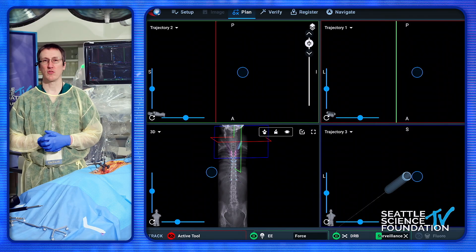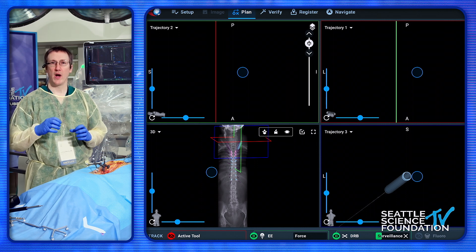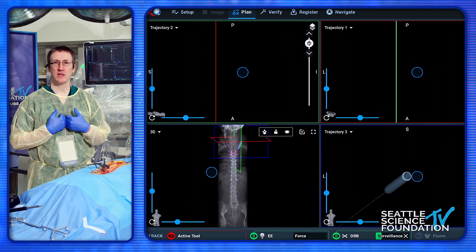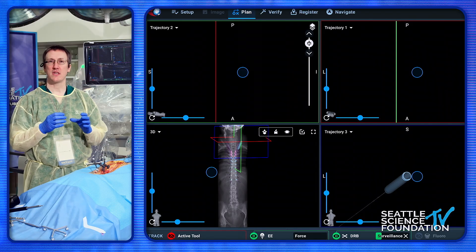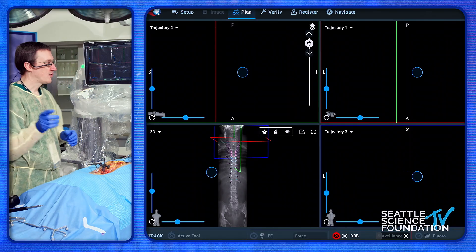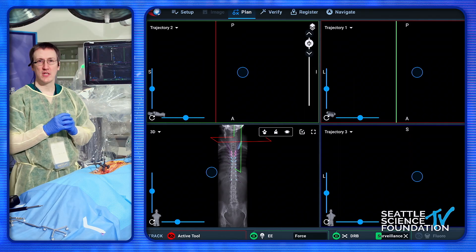Make any changes the next morning and really have that plan be where you want it to be. One of the things that's nice about preoperative planning is you can plan the screws you want to use — you want to maximize that minimal pedicle, engage that cortical bone, get the right length. In my experience doing robotic surgery, I'm using larger screws and placing them in trajectories I wouldn't have done open. On the screen there's an XYZ axis and you can actually march down the pedicle and see where it's going, making sure you're engaging in that actual bone.